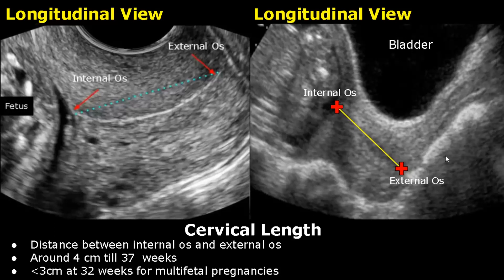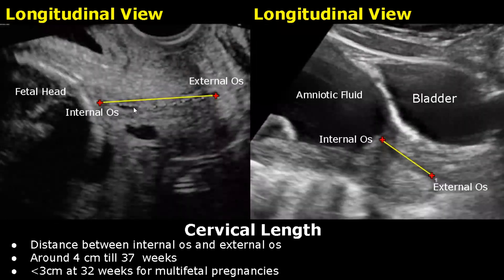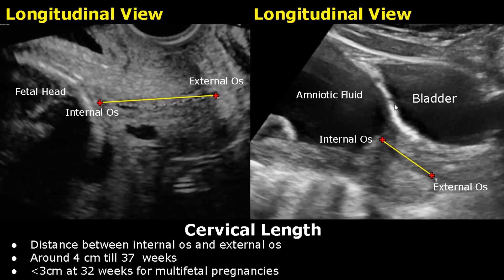Here are more images showing measurement of cervical length. On the left side is a transvaginal approach with calipers placed for measurement of cervical length, and on the right side is a transabdominal approach. This is the bladder, and this is amniotic fluid.